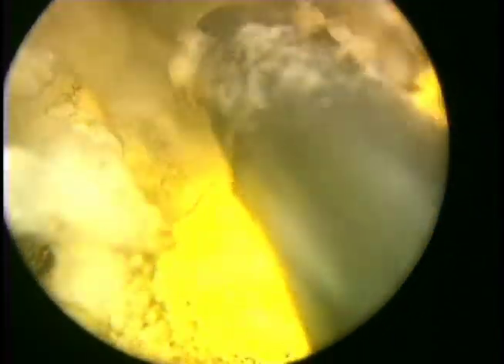Here we begin to appreciate the fibers of the surgical capsule near the 5 o'clock area of the bladder neck. This will be widened and slowly brought back proximally toward the verumontanum.